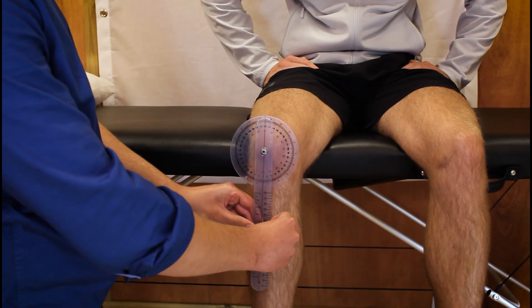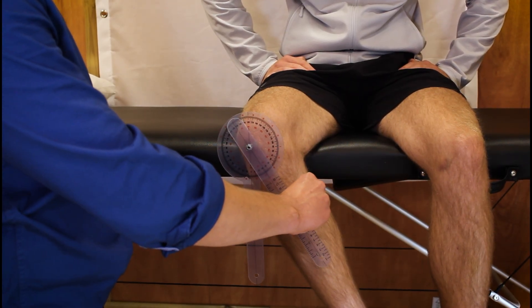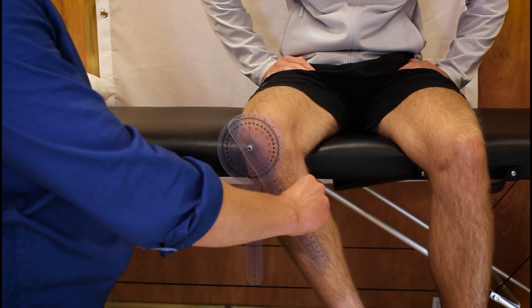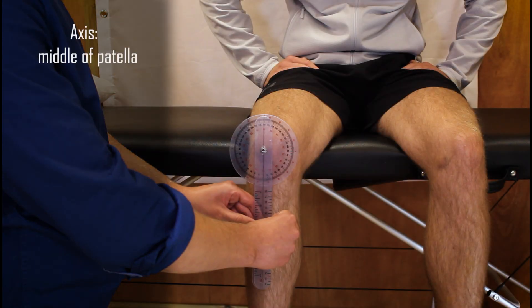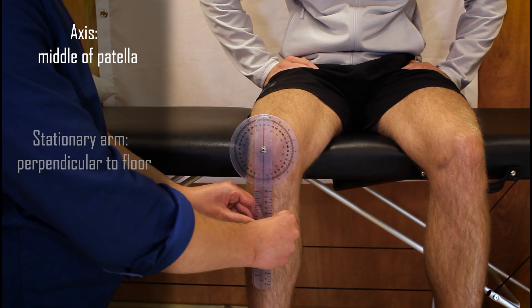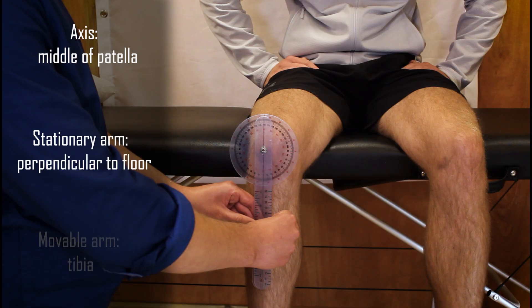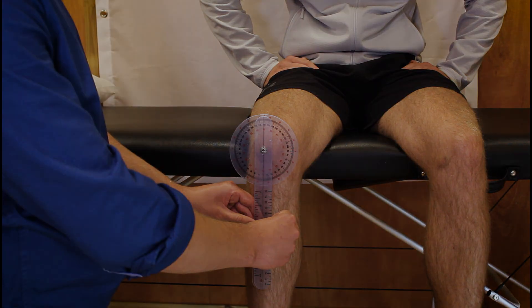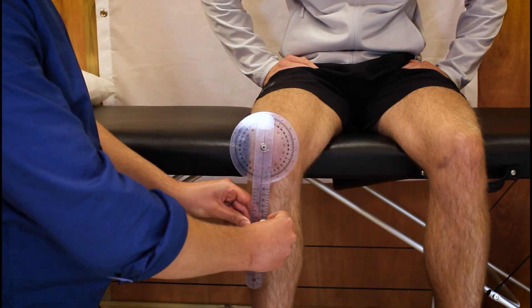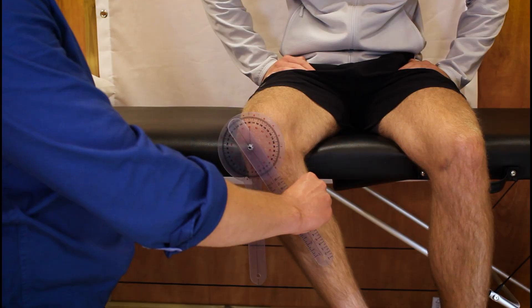To measure hip external rotation, the patient is positioned in sitting with the hip and knee at 90 degrees. The axis of the goniometer is placed over the midpoint of the patella, with the stationary arm perpendicular to the floor and the movable arm parallel to the tibia. Ask the patient to twist their hip so that their foot pulls inwards.